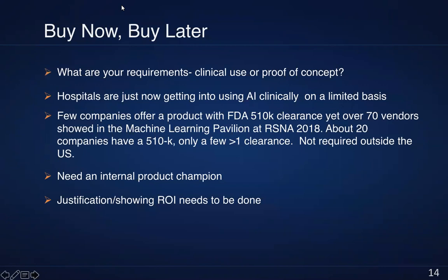As we mentioned several times before, there are probably 20 or so companies that have a 510K out of the 70 plus companies who are competing in this marketplace. And there are just a couple of companies that have more than one clearance, that have more than one solution. It's also important to understand that a 510K is not required outside the US.